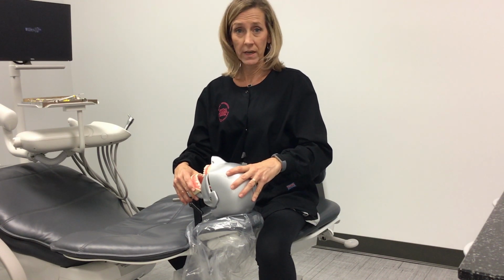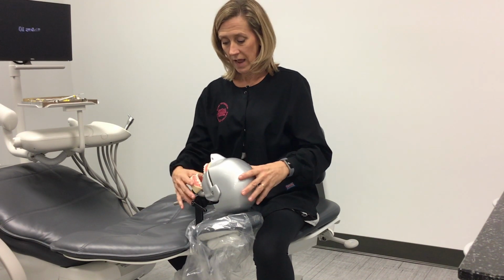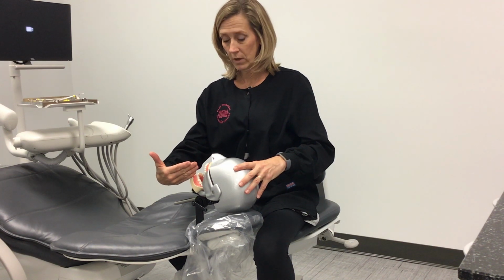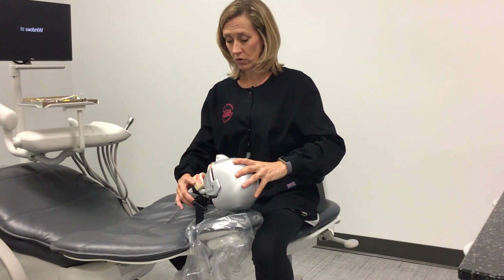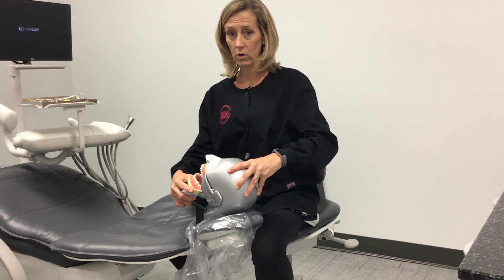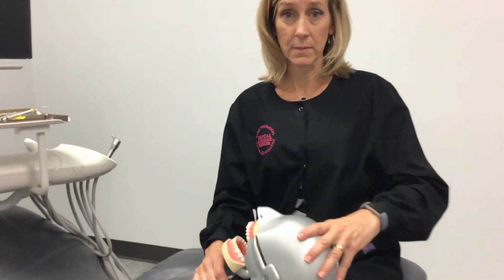The other thing we need to remember is that our patient's chin will always be down for the mandibular anteriors, and as you start, you would start on the canine furthest away from you with your patient turned toward you. As you work across the anteriors, your patient's head will be turning away from you as you work toward you. Now, what we're going to do next is talk about preparing for your actual assessment stroke.